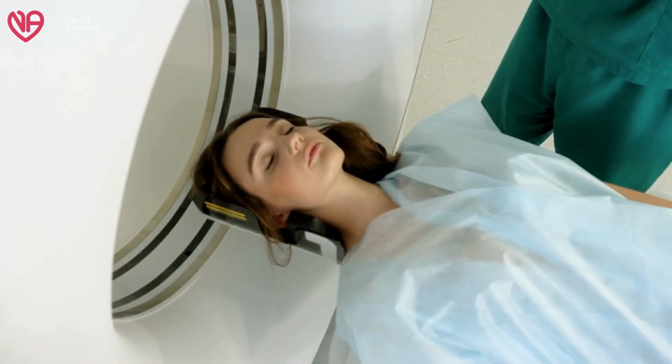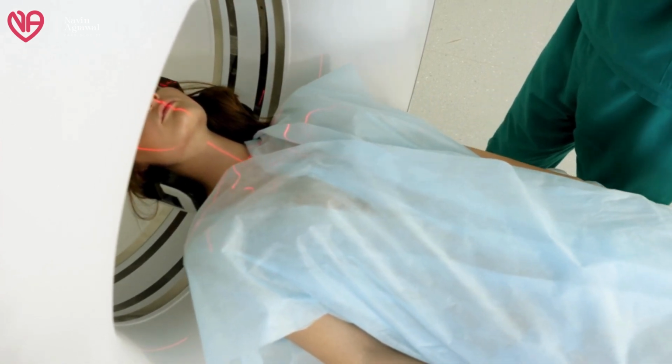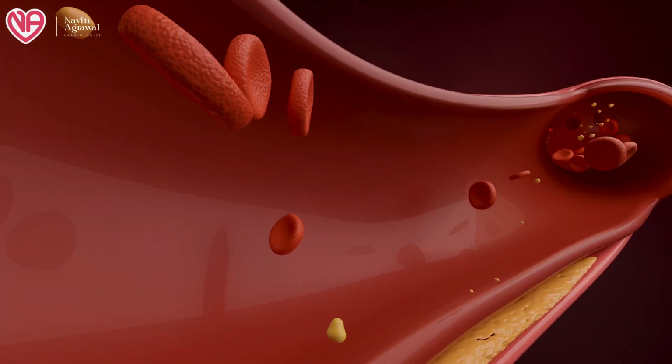In comparison, in a CT angio, the catheter is not taken into the heart, and directly from the venous cannula we inject a contrast forcibly, and that is used to opacify the coronary vessels. So comparatively, if you talk about the safety of the patient, conventional catheter angio has slightly more amount of risk, especially in patients where there are critical blockages and multiple blockages in the main vessels or the left main artery.